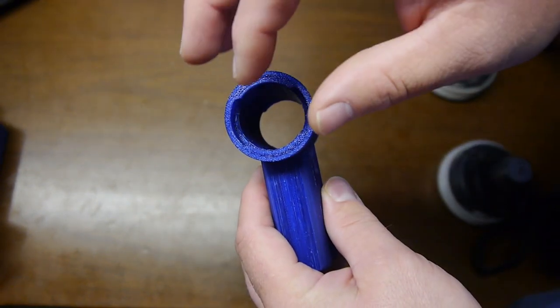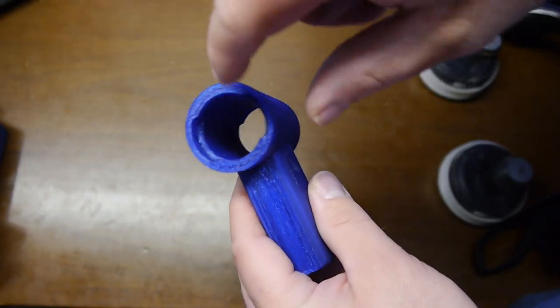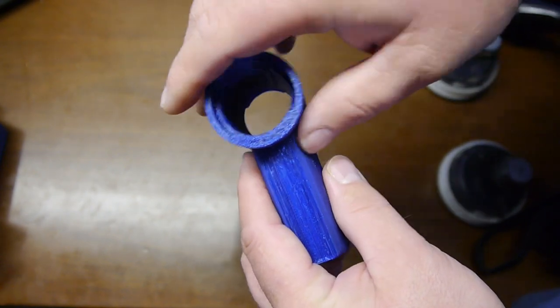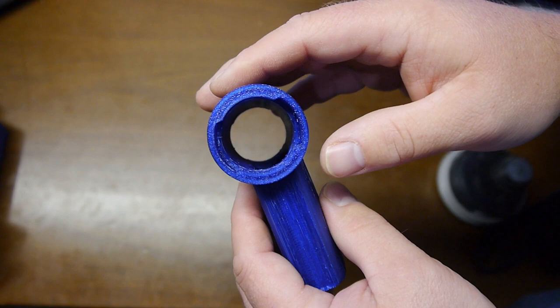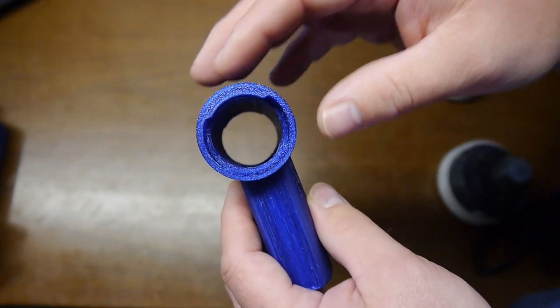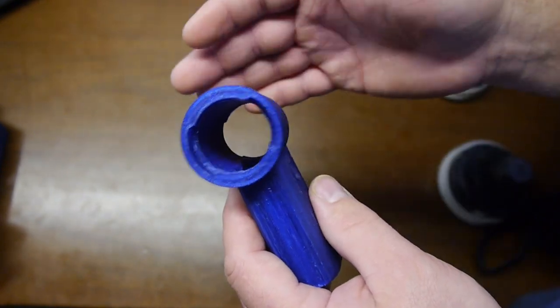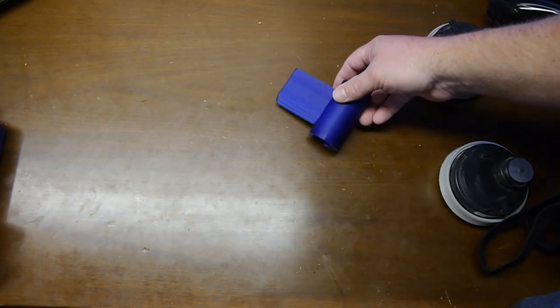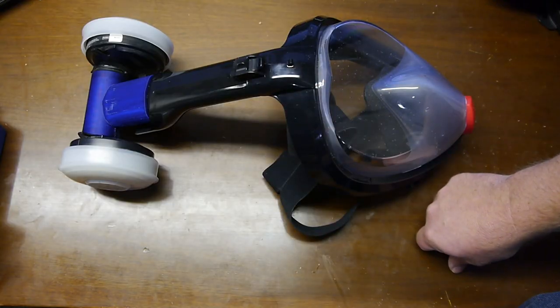Reason being is you may have a threaded version, you may have something that requires a different type of mechanism to lock it in place, and it'll let you modify the step file to incorporate whatever threads you may have. And I think that's the best I can do at the moment. Hopefully this helps people out there.